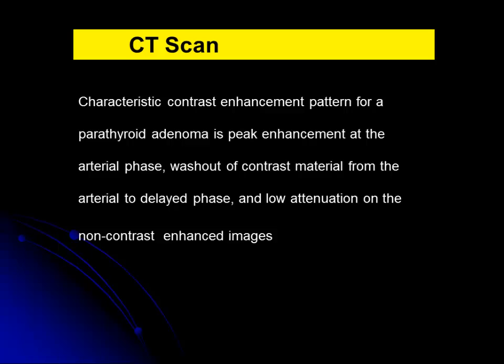Looking at CT, if you do a contrast enhanced CT, it enhances with the arterial flow, and you see a bright high density lesion. It could be posterior to the thyroid, it could be an ectopic site, and it peaks at the peak arterial phase, that is 20 seconds after injection of the contrast, and it washes out.